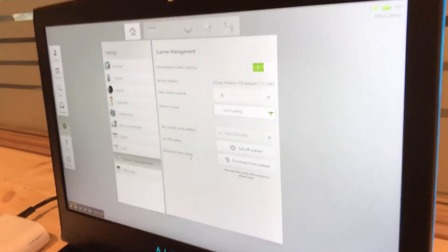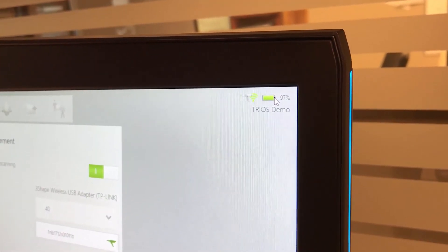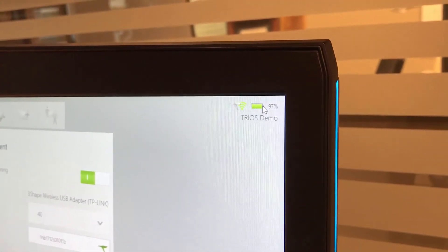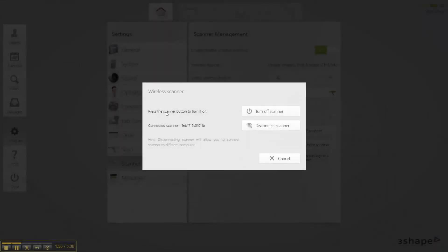On the right-hand side of the screen there's a new icon that shows you the battery power of the actual scanner — it's at 97%. If you select this, you can press to turn off the functionality of the scanner, or you can disconnect the wireless from the scanner as well.